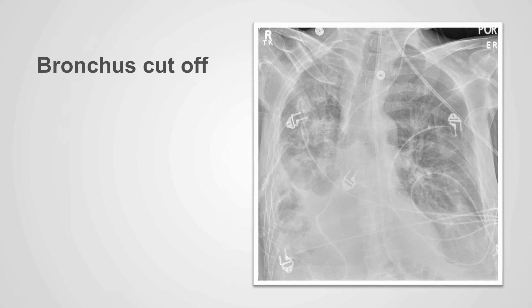Tracheal or bronchial narrowing can be focal or diffuse, and sometimes can lead to complete obstruction of the affected bronchus. In this example, we can follow the trachea inferiorly and identify the left main stem bronchus. However, we can only see the more proximal portion of the right main stem bronchus, as there is complete and abrupt cut-off of the air within the bronchus by an underlying endobronchial tumor.